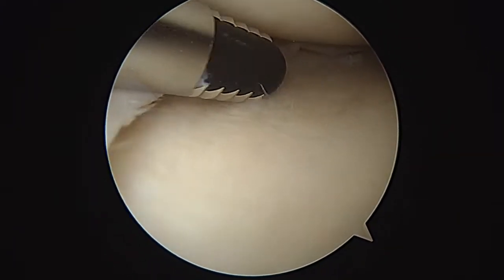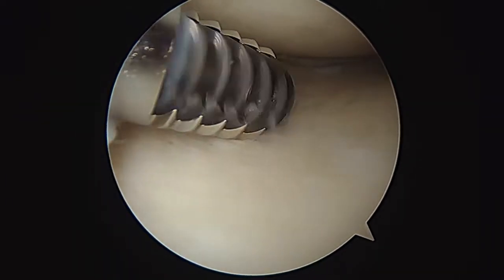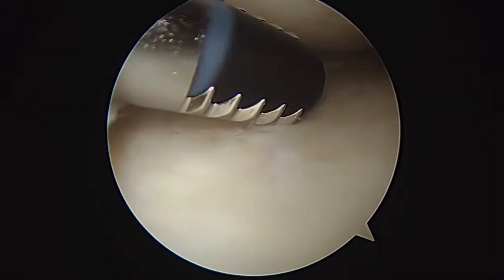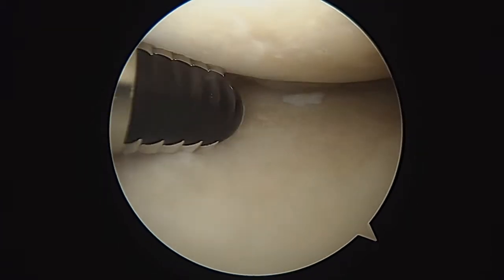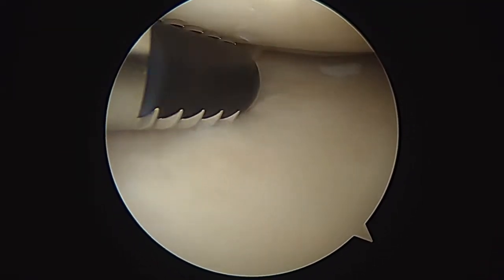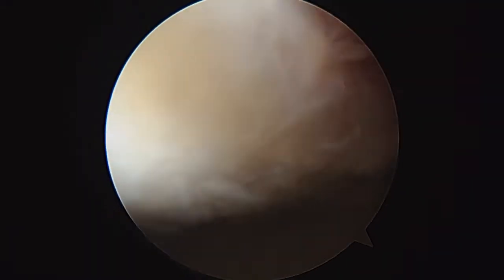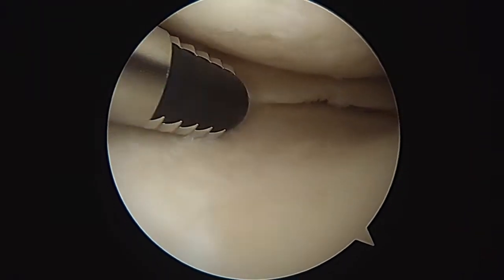Now we're looking in the medial compartment. You can see our shaver here. When I turn it on, it spins around, and that inner tube has suction attached to it. So when we turn on the suction, it'll evacuate out these really loose pieces. There's a loose piece there you can see — here's one right there.